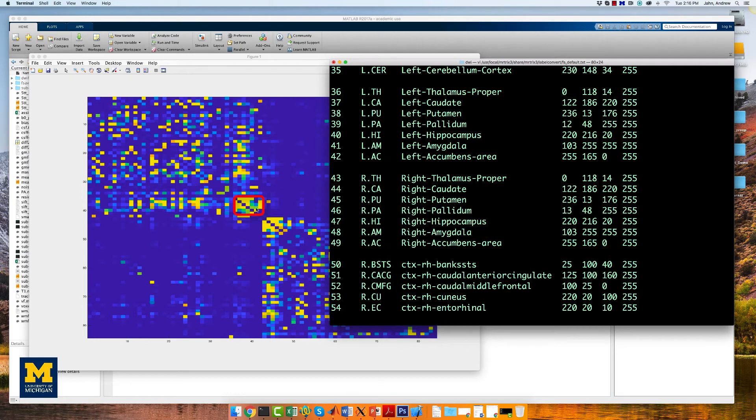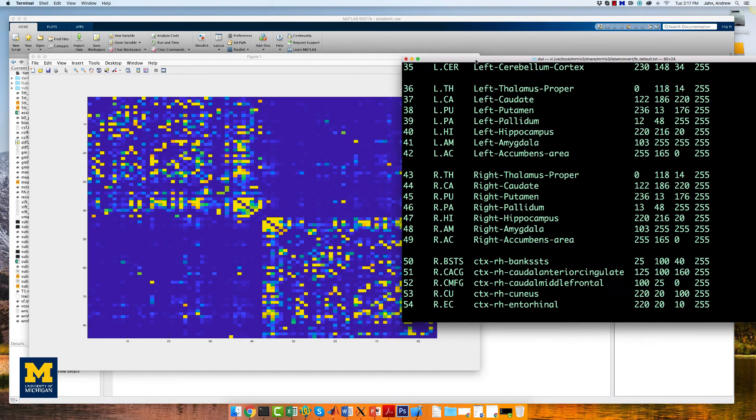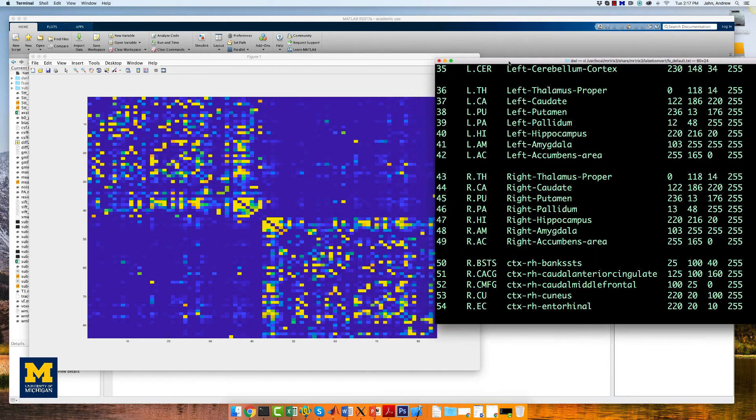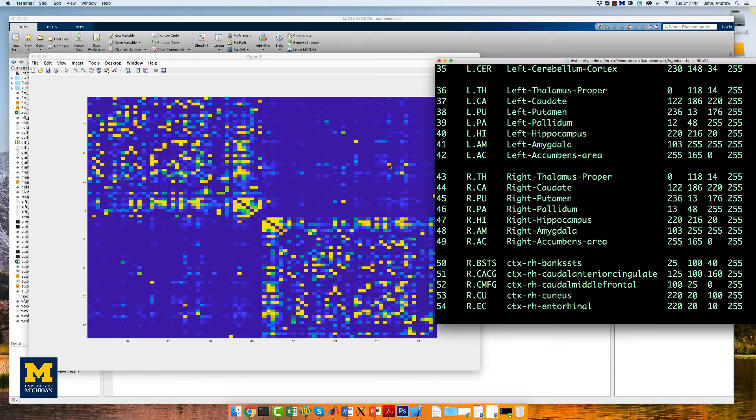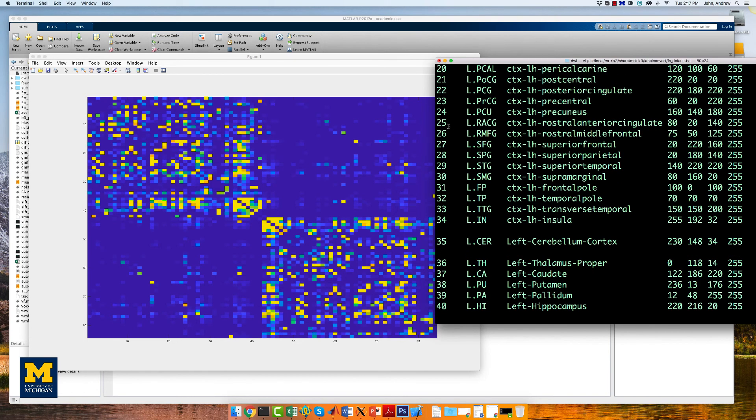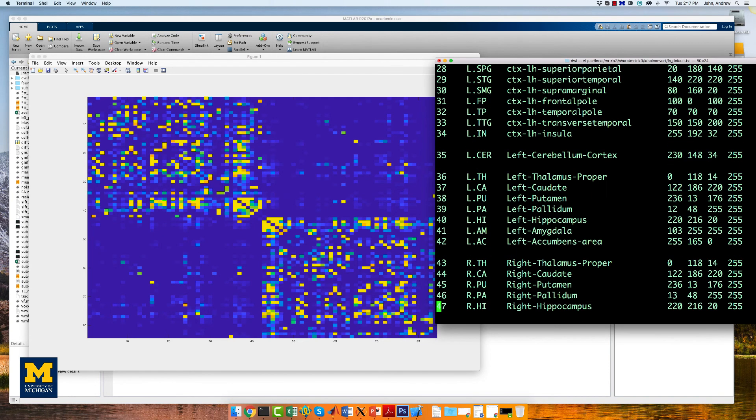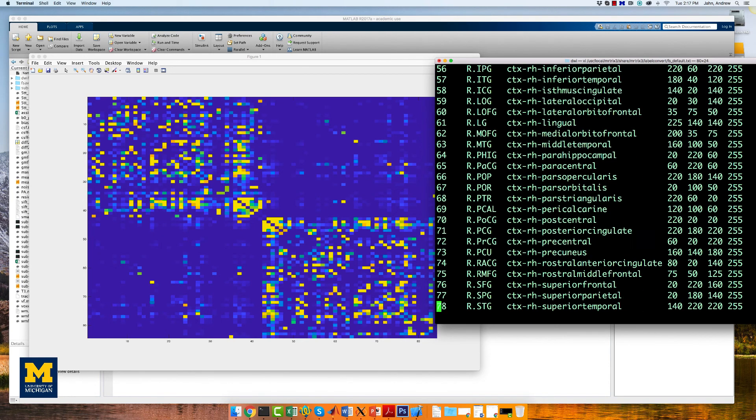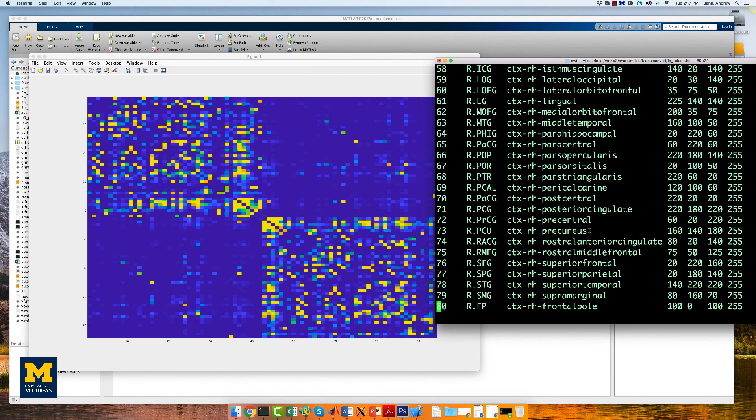And the same for the right subcortical structures, which you can see over here. Brighter voxels far away from the diagonal can sometimes represent increased structural connectivity between homologous regions. If you look up the numbers for the rows and columns for this voxel here, for example, you will find that it corresponds to the correlation between nodes 24 and 73, which are the left and right precuneus.